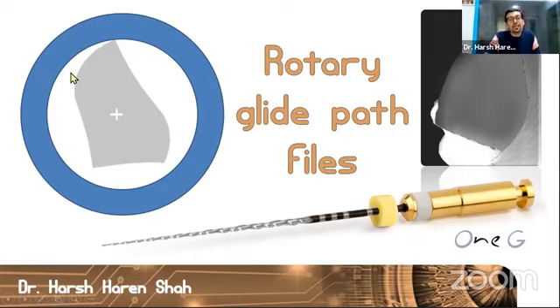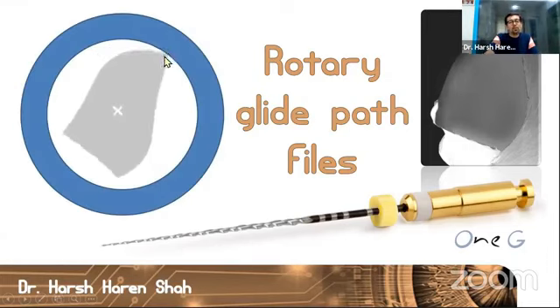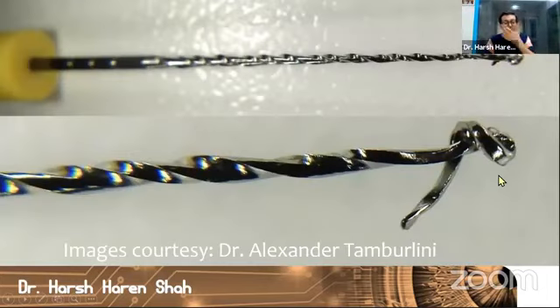Plus, God forbid, if this instrument separates when you're doing your glide path preparation, just imagine the ease that you will have to bypass this separated instrument, because you will have so much of space available all around the file for bypassing the instrument. So that's how this file will rotate, and only one edge will be touching the walls. This is just one of the glide path preparation files which are available in the market, and this is called 1G.